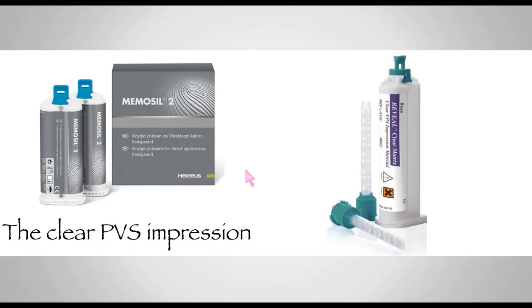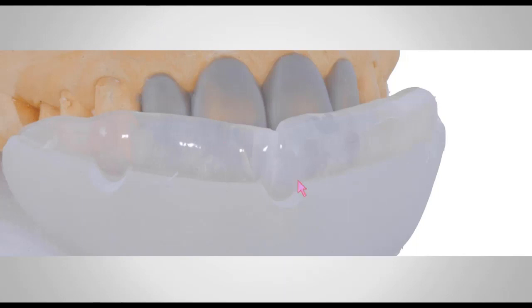All you're going to do now is choose a clear PVS impression material. There are two that I know of on the market, and I use both of them in my practice. This can be either Memosil from Heraeus Kulzer or Reveal from Bisco. They both do exactly the same thing. They're both great products. They flow very nicely, so they copy all the details that you have on your wax up. Whichever you decide to use is good with me.